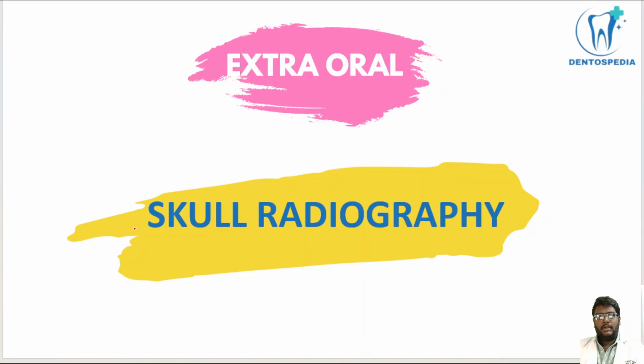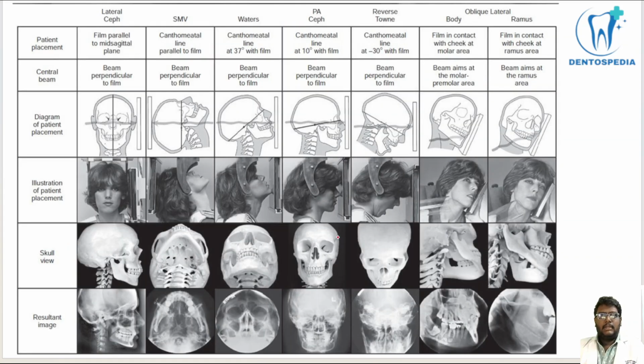And coming to extraoral radiography, usually we go for skull radiography in the maxillofacial region, especially for fractures, tumors, and cysts. Okay, and this is a common radiography which we use in our dentistry. Here you can see the various techniques for skull radiography. Here we have lateral cephalogram, submental vertex projection, Waters projection, posterior anterior cephalogram, reverse Towne projection, okay, and also oblique lateral projection.